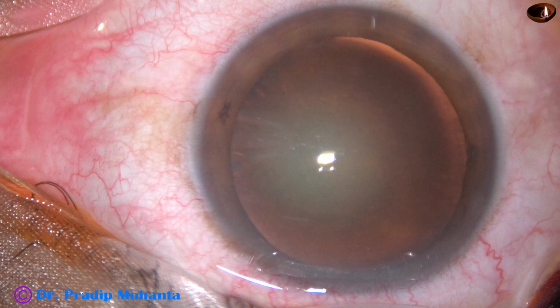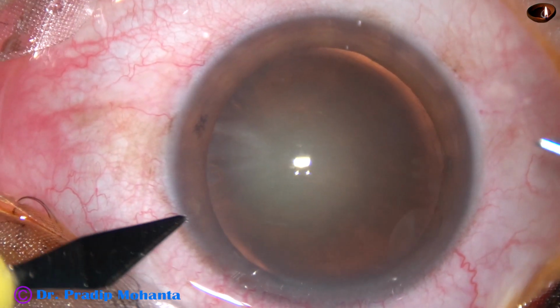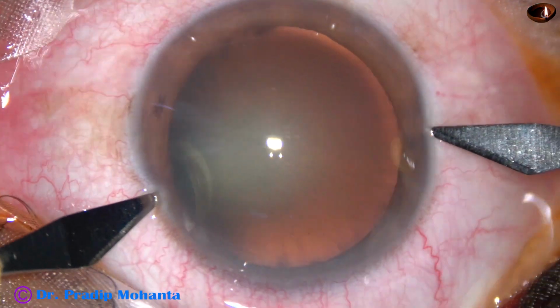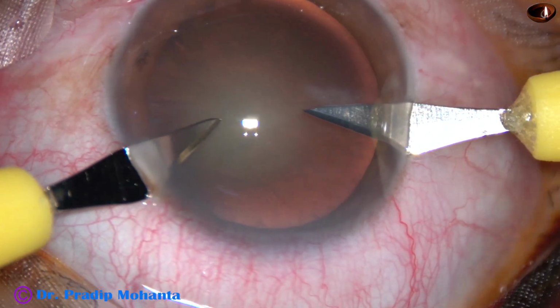This is a cataract with grade 3 nuclear sclerosis. Let us observe this surgery. Two side ports are made, one at 9 o'clock, another at 2 o'clock.